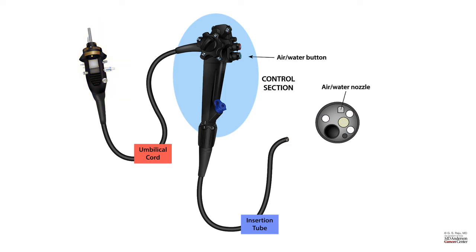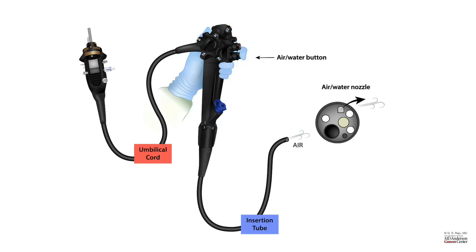Air-water channel or air-water nozzle, and if you press the air-water button or occlude the button gently, air or CO2 comes out. And if you are wondering how does air or CO2 come down, it is again at the light source connector. There is an air pump pipe and an air/CO2 connector.